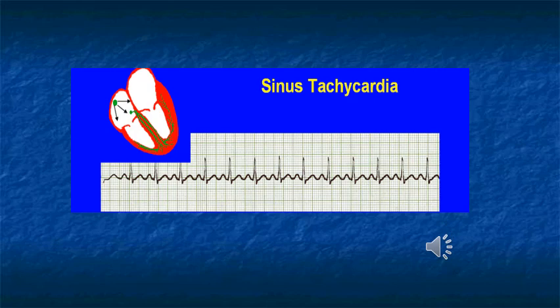This slide differs from the previous one in that the heart rate here is 125 beats per minute. So this is sinus tachycardia.